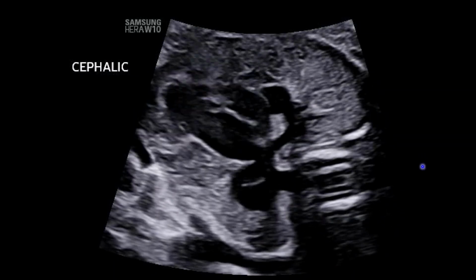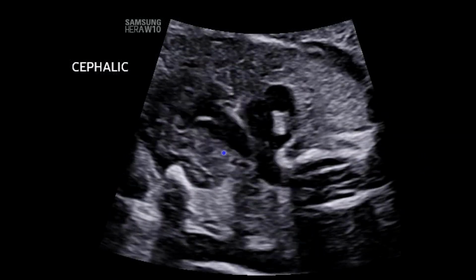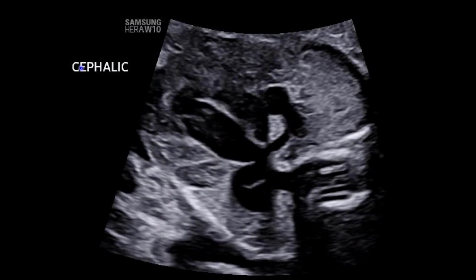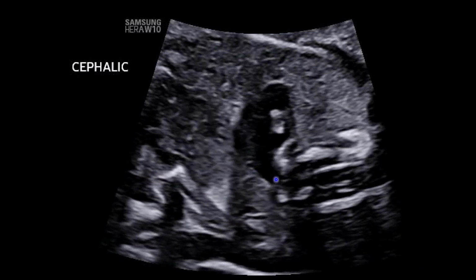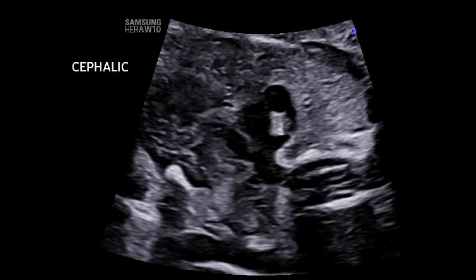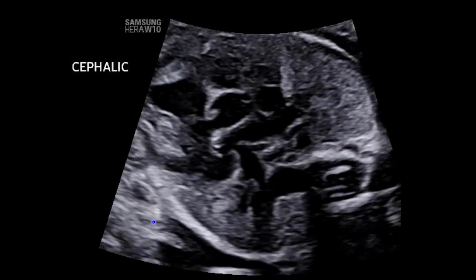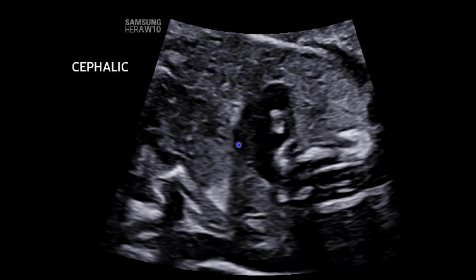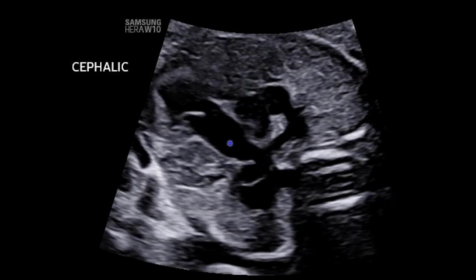Another case here, we have another tortuous duct. Here's the MPA, and then this is a cephalic presenting fetus, but this is the spine here. The front of the fetus is here, so this is right over here. This is left. We have levocardia. Here is the main pulmonary artery, and you can see just how tortuous this duct is right here.